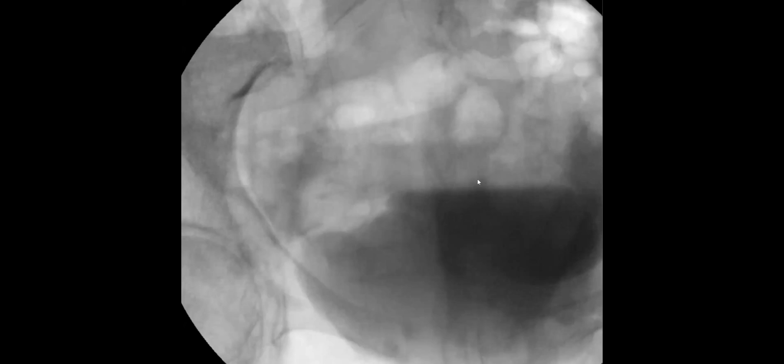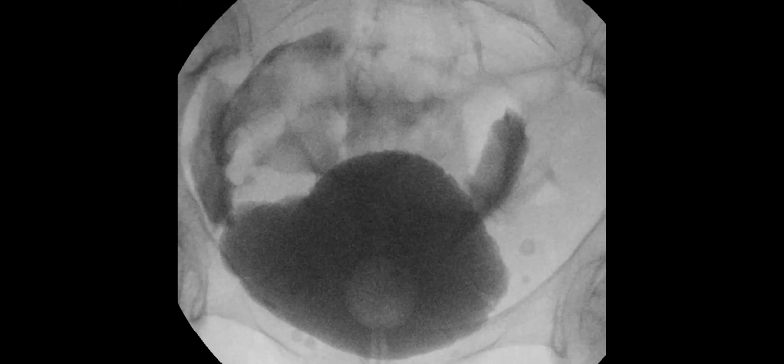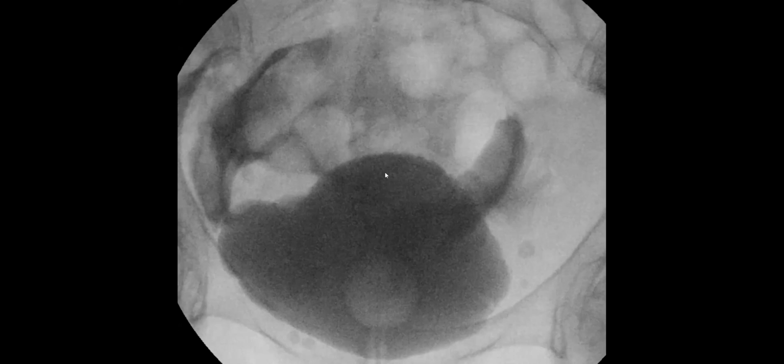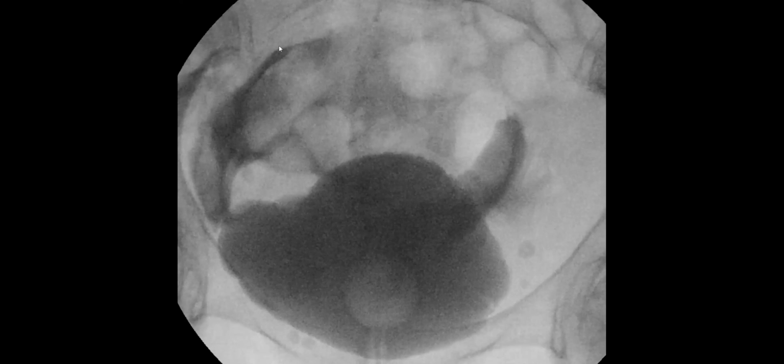Intraperitoneal rupture. Why do you need a VCUG though? Exactly. Yeah, the CT was done afterwards. And again, you might ask, why do you need a CT? One or the other is enough, right? So this is iatrogenic, post hysterectomy. They had sent for a VCUG first, and the VCUG appropriately demonstrates the findings. You have leak of contrast, and the contrast opacifies small bowel loops in the pelvis. So indeed, this is intraperitoneal rupture.